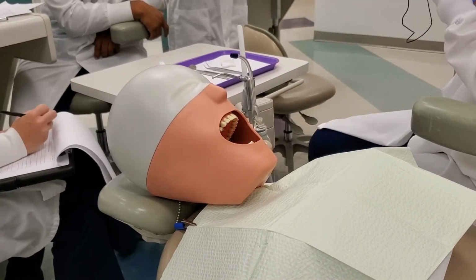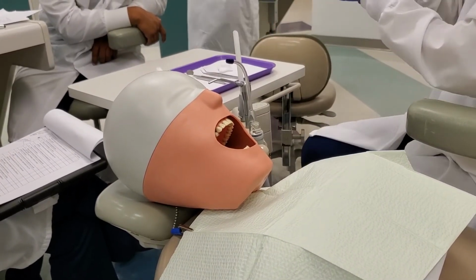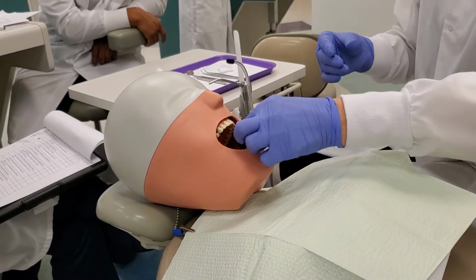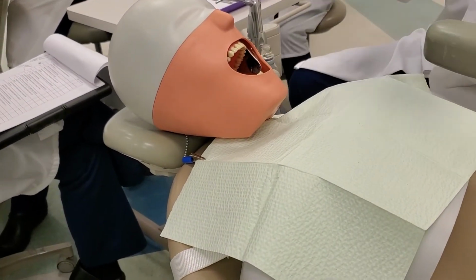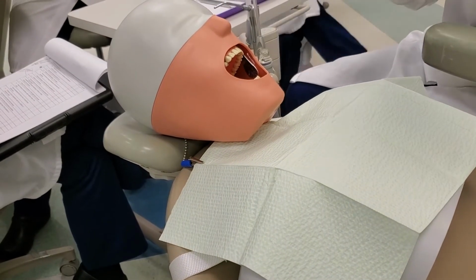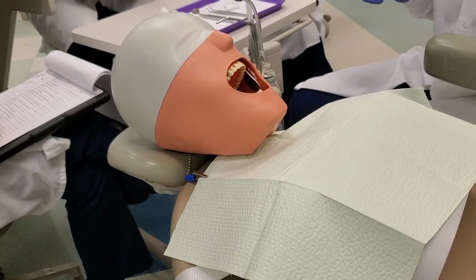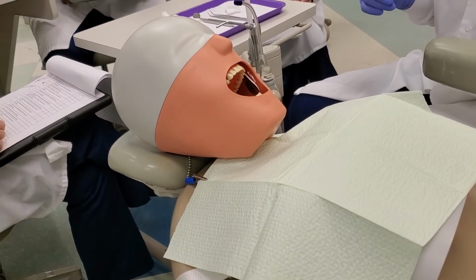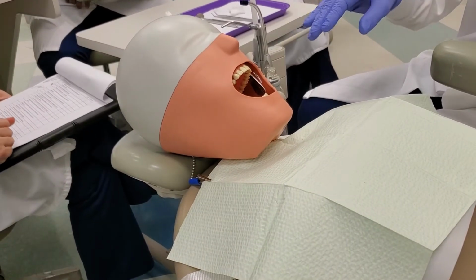Oh, yeah. Thank you. Okay. So on a normal person, this is going to come in, you're going to place it, and it's going to stick, hopefully. Okay, good. Nobody breathe. It's sticking. So that's where it's going to go, though. That's where it's going to be located, on the patient. And if you guys are working on each other, you're going to place it right here as well. Okay, so you place the dry angle over the Stenson's duct.